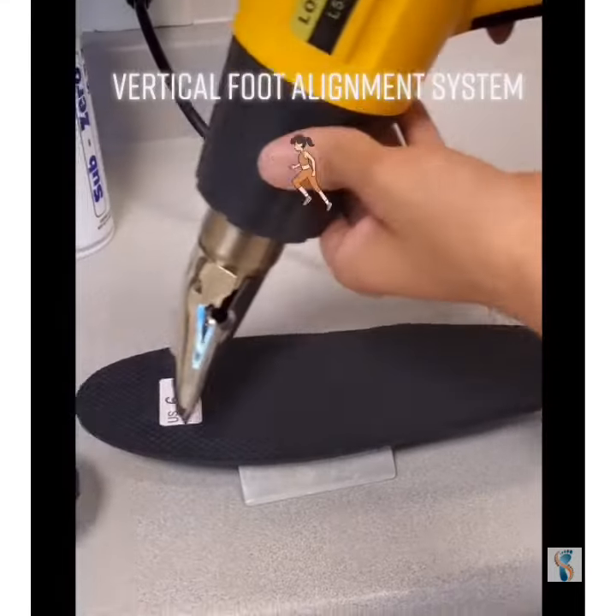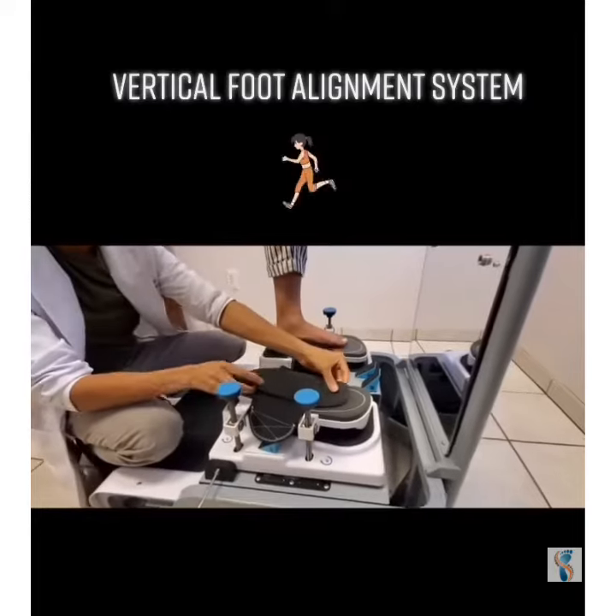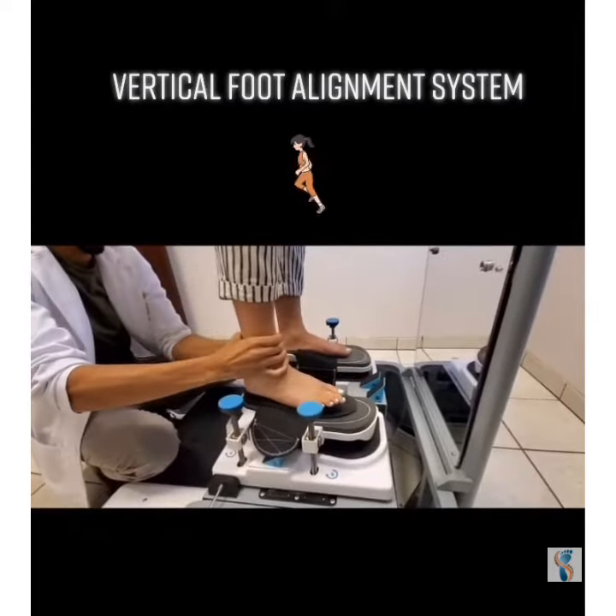Here at Laser Foot Surgery Center, I'm lucky enough to obtain the Vertical Foot Alignment System. This is the only fully weight-bearing orthotic system available in the U.S., and this allows the patient to get the orthotics the very same day.